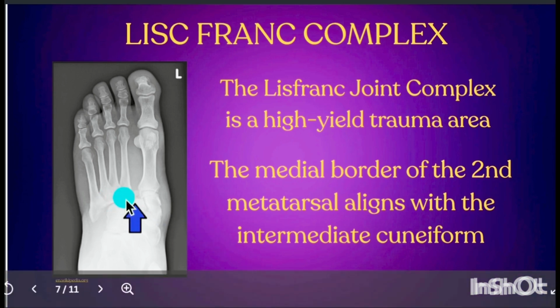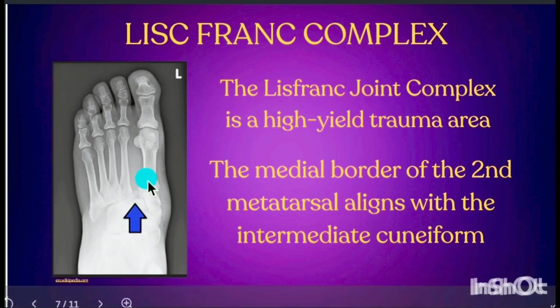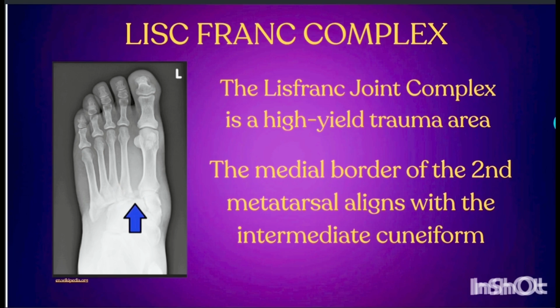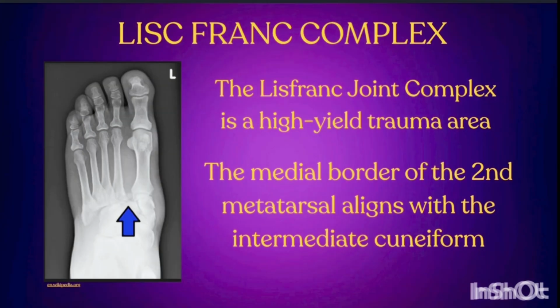So right here you can see that the medial border of the second metatarsal, so here's your first metatarsal and your second, so that space in between, this is where the intermediate cuneiform aligns with that. It becomes displaced and it can be very painful. So this type of injury can be subtle or obvious on the X-ray and can be very painful for the patient to bear weight. They may experience swelling in the midfoot area, and symptoms may vary depending on the extent of the injury.